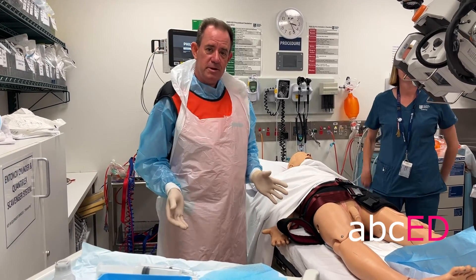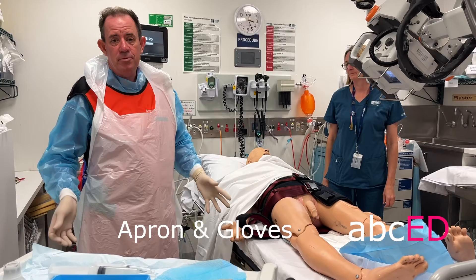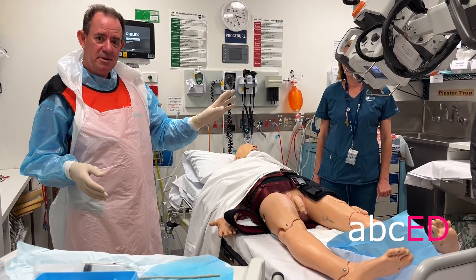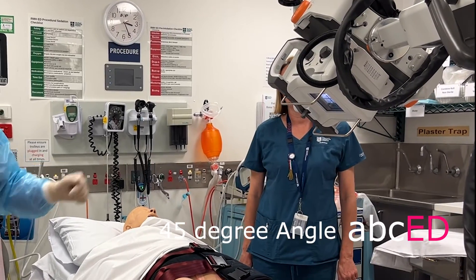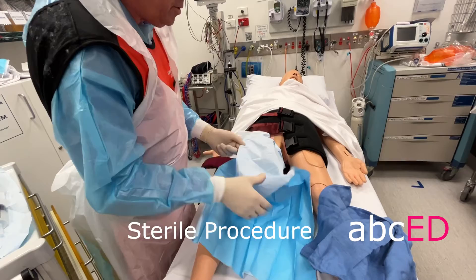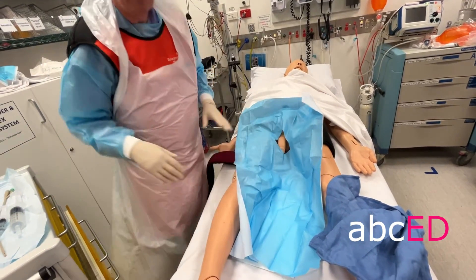Stand on the patient's right side wearing a lead gown, plastic apron, and sterile gloves. Have your radiographer standing on the patient's left-hand side with the x-ray tube angled at 45 degrees towards the patient. Put the plate underneath. Have the lower strap of the pelvic binder undone, and use a sterile field as you would for any urinary catheterisation.